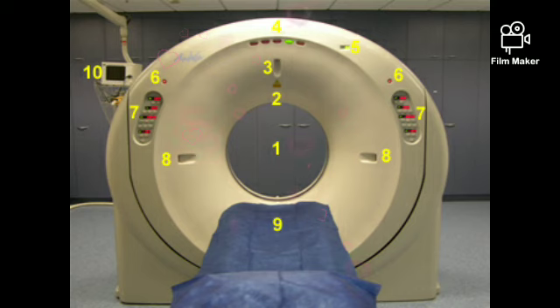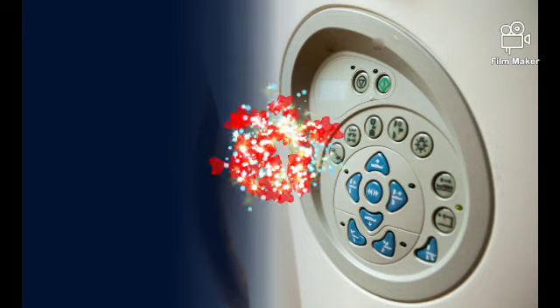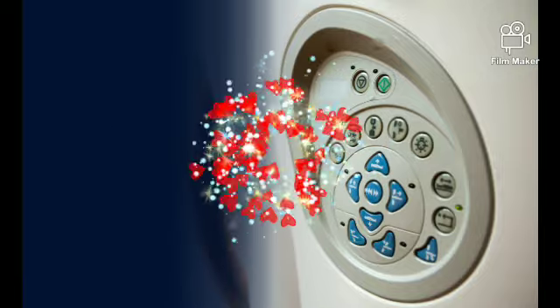And number 9, that is the patient couch. So I hope now it is very clear to you about the topic for the day, and the topic for the day is CT control panel indicators.